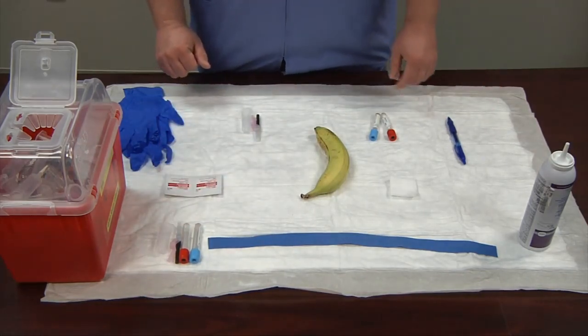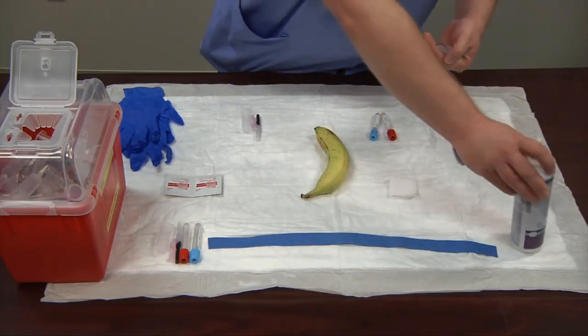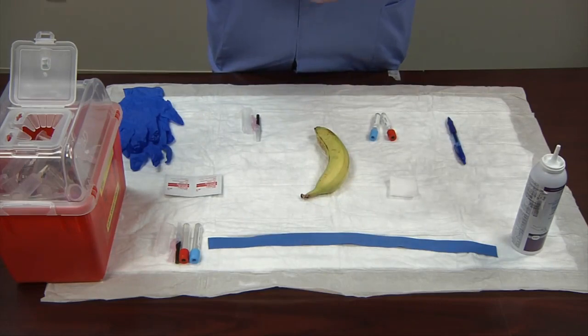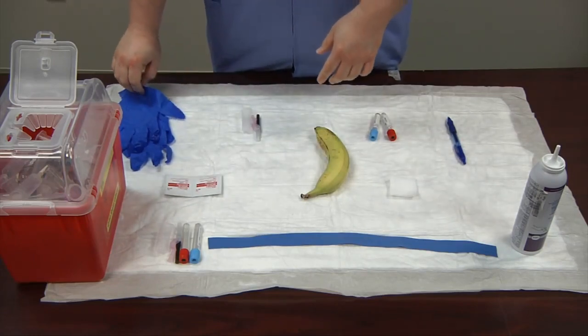The first thing I'm going to do is wash my hands. It's important to always wash your hands before and after every patient. When using an alcohol wash, rub your hands vigorously until the substance is dried. If washing with soap and water, sing the happy birthday song twice in your head to wash your hands long enough.